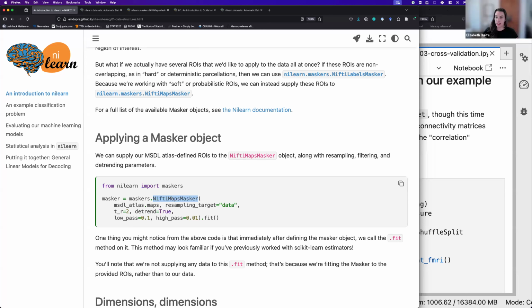Okay, I think I heard it, but please correct me if I'm wrong. So I think the question is basically, you may have some atlases that correspond to a particular network or a particular question. You may have other atlases that don't. What are the thoughts on using multiple atlases?